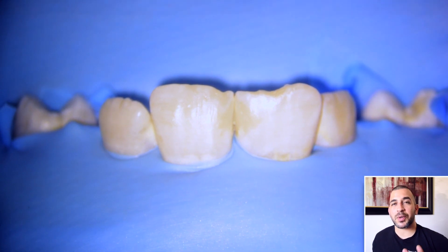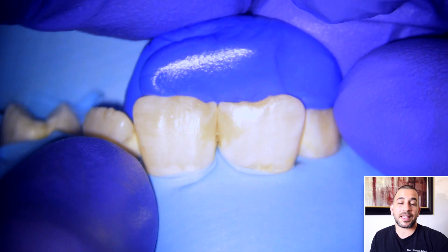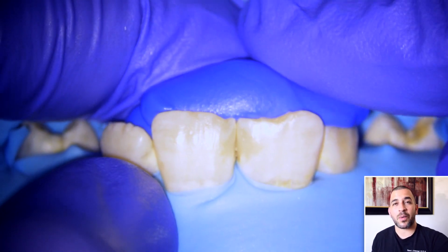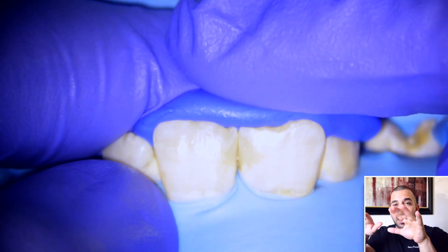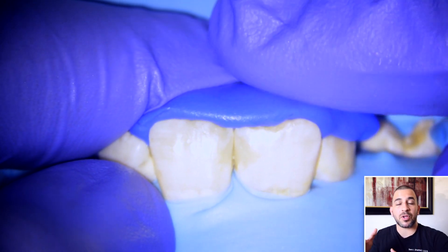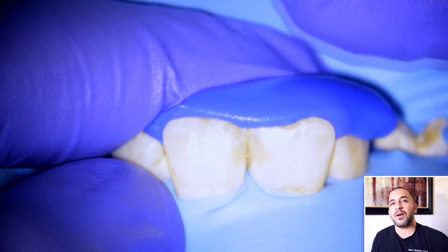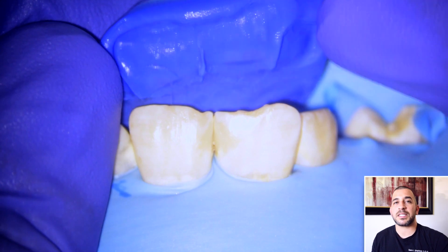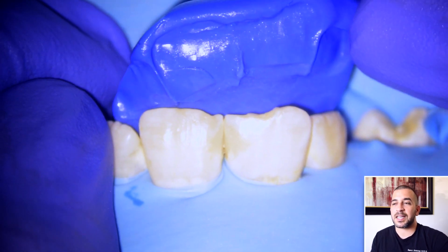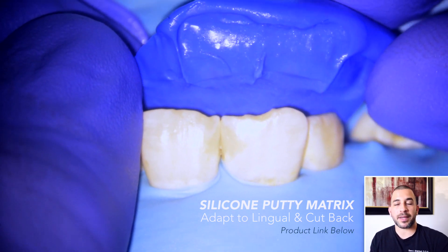In today's video, I'm going to be showing you guys how I like to repair broken front teeth on kids. In this particular case, I want to illustrate how you can create length to the teeth as well as shape the teeth to make them look a bit more ideal before a child undergoes orthodontic therapy or places his braces on. You don't always have to do this, but since it's my cousin it's just something that I wanted to show on video, so I hope you guys enjoy it.